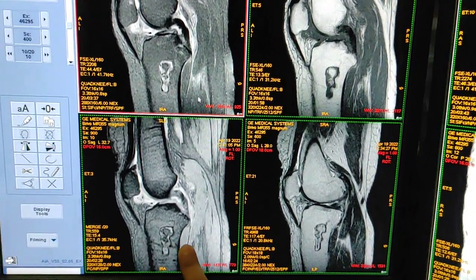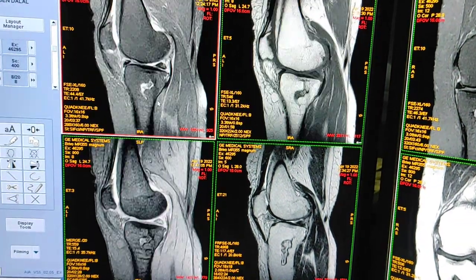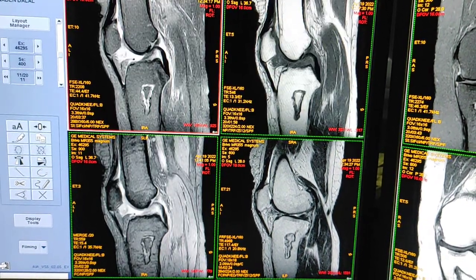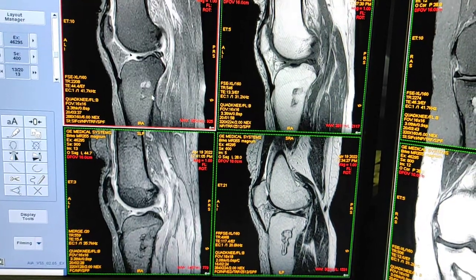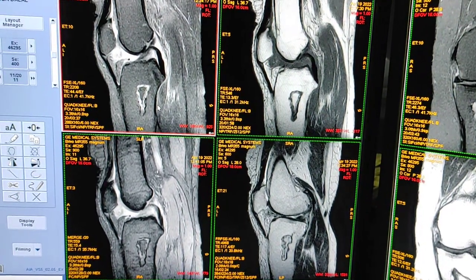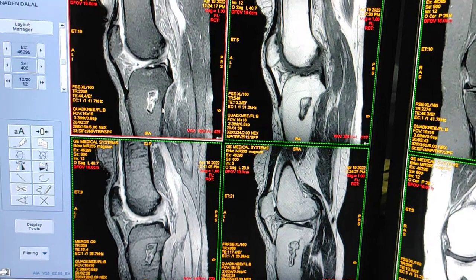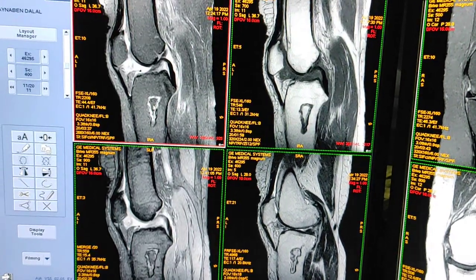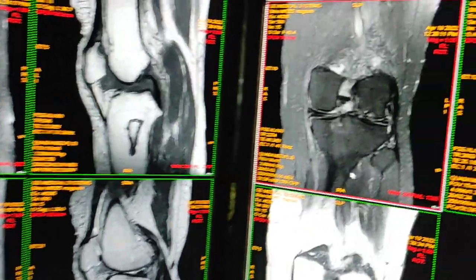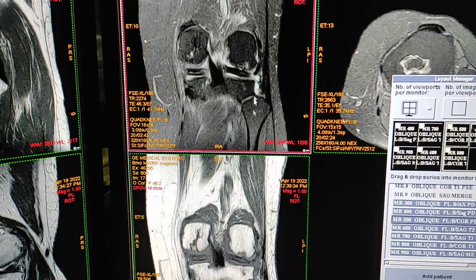This is fat-sat PD, this is T1, and here is the hypointense rim on T2 weighted. This one is the gradient image. From this type of picture you can say this is bone infarct. The size of the lesion is approximately 3.5 centimeters. The lesion is located in the upper tibial shaft.